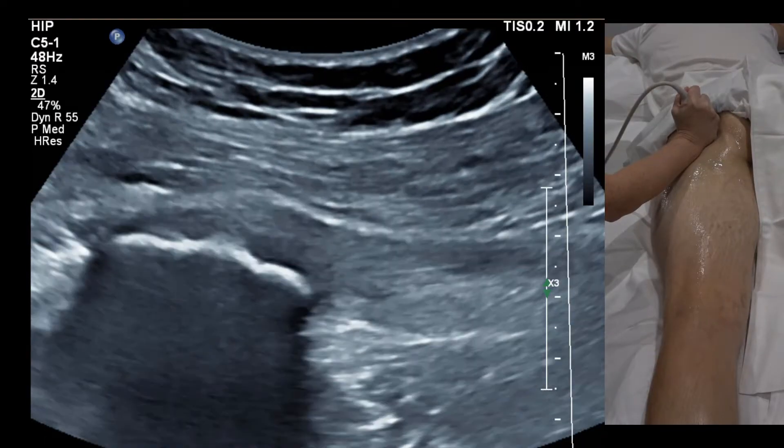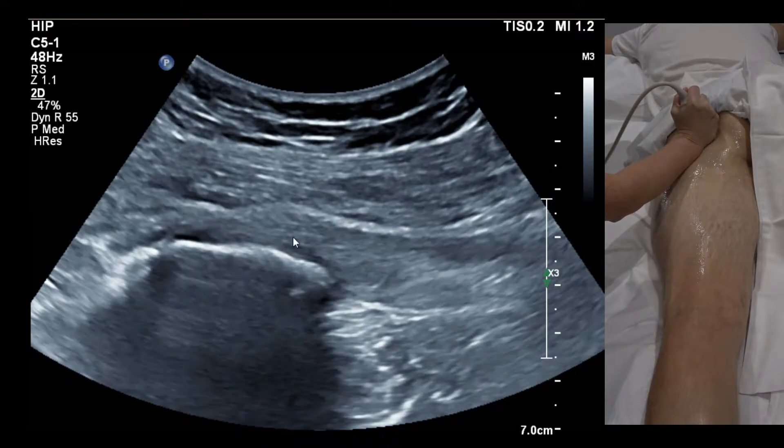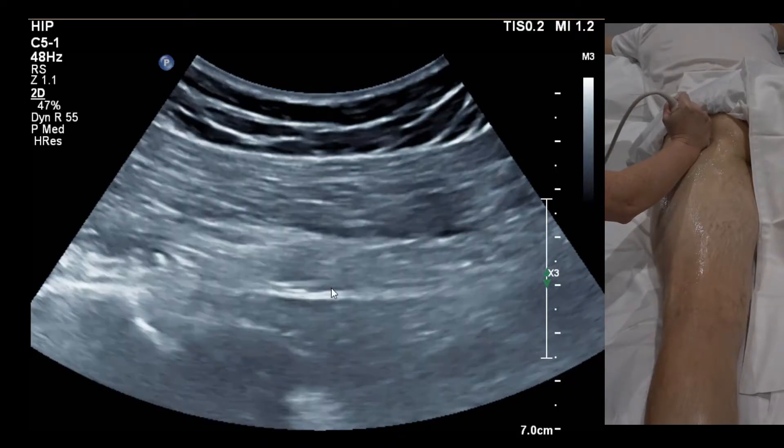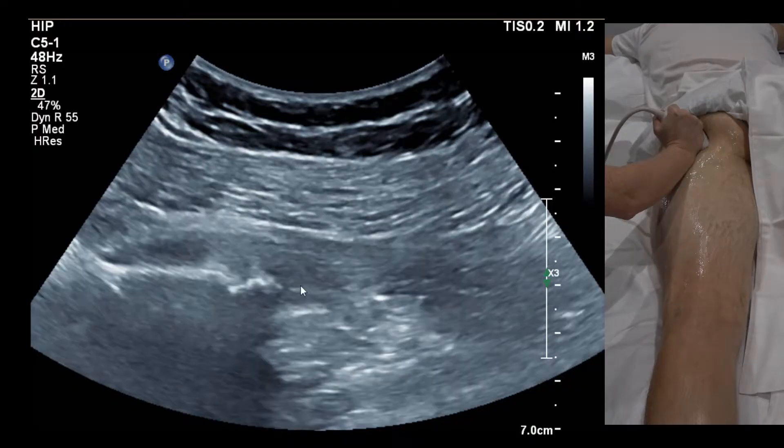A curvilinear probe will be needed in a lot of patients. Here's the conjoint tendon, and coming a little more lateral, angling in and pushing hard, this is semimembranosis.